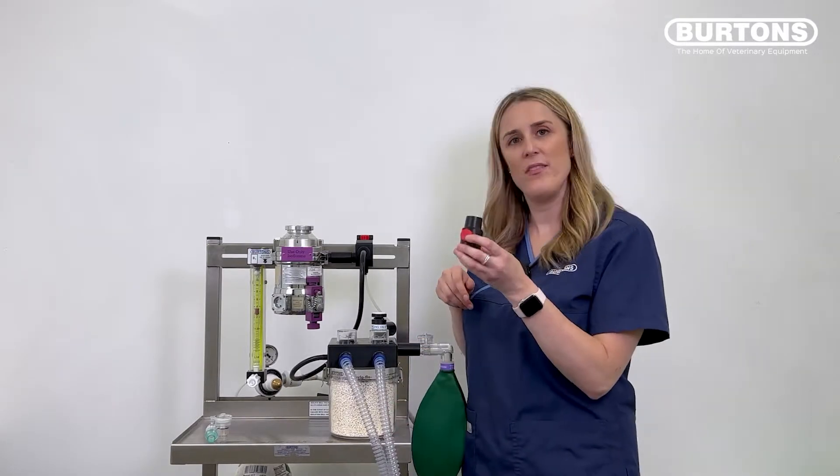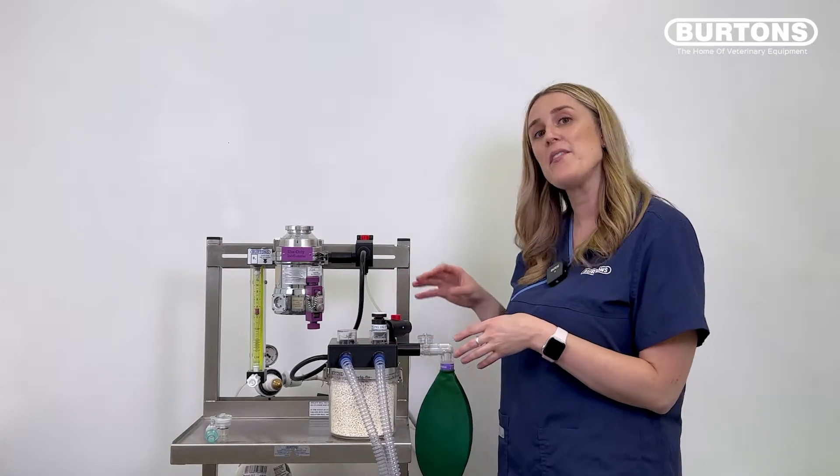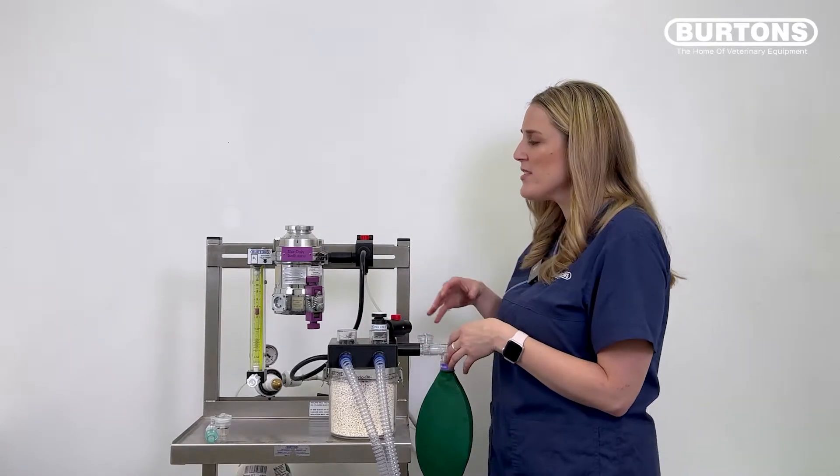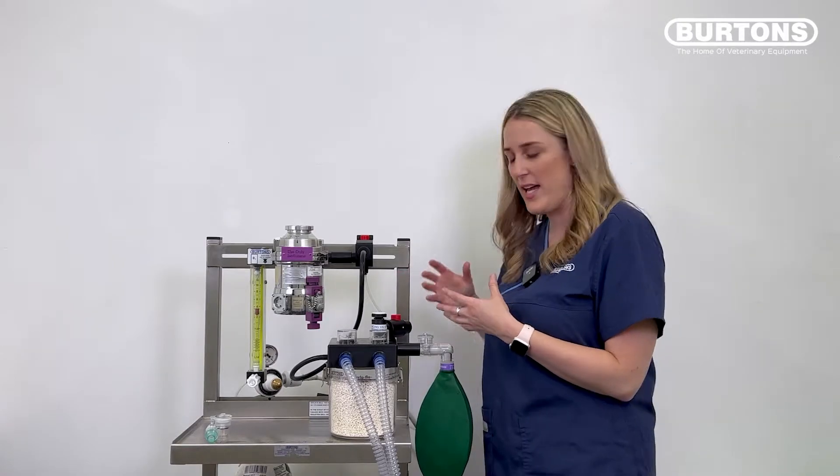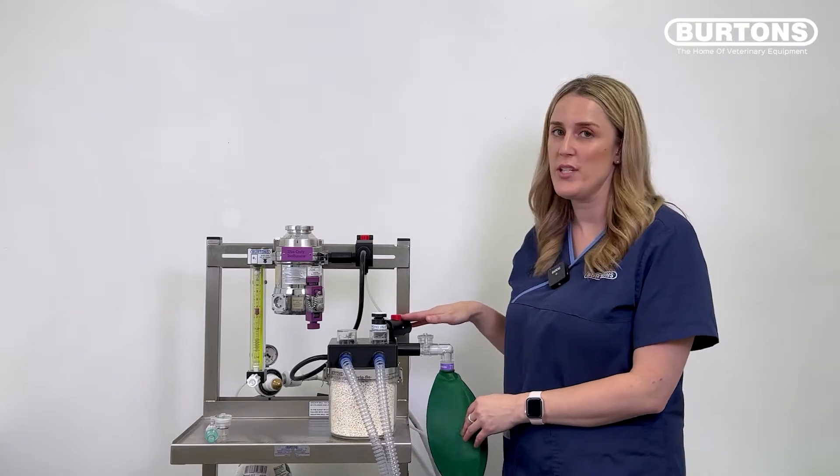Now I have the IPPV button valve, I just need to attach that to the scavenge. You can imagine that we would have scavenging tubing here but because I'm only using oxygen I don't have to have a scavenging system in place here but you can imagine this is exactly where you would attach yours.